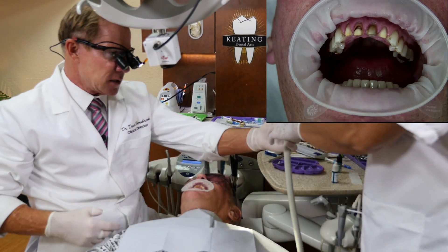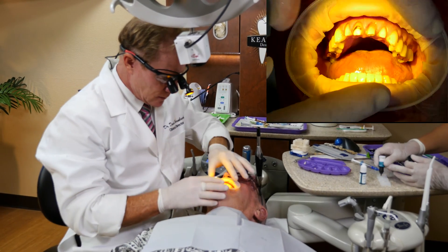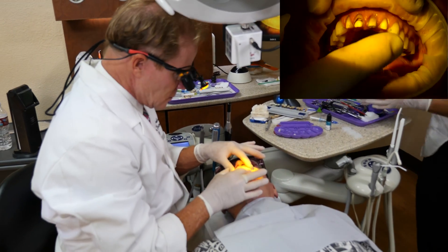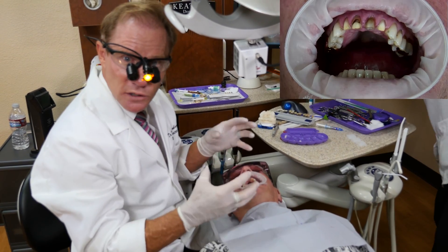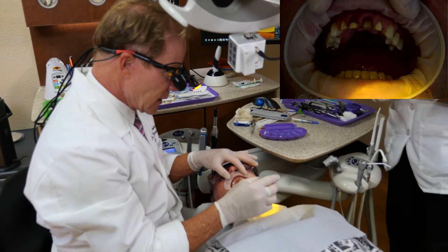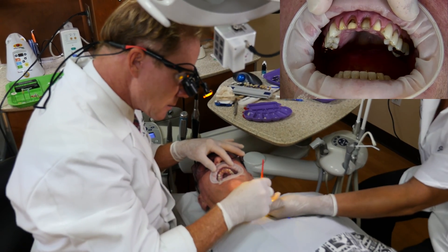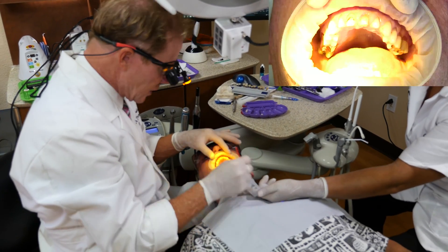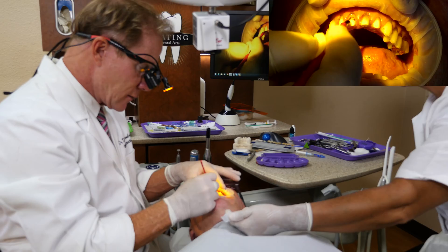Let's go ahead and mix the primer. We're going to be using All Bond 3, which is a fourth generation dentin adhesive. I've left the prep slightly moist. All Bond 3 is a dual cure material, so it actually has a photo initiator as well. The primer is two parts, A and B. We'll mix it up and apply multiple coats, making sure we get enough resin to infiltrate the hybrid zone and create a true hybrid zone, covering both dentin and enamel.